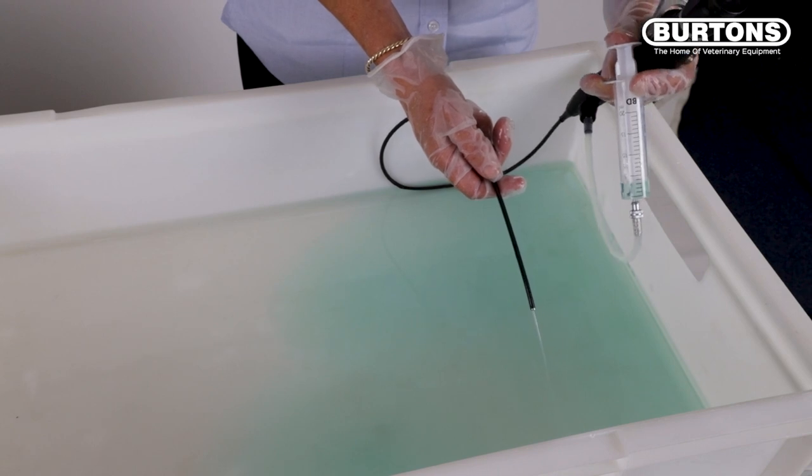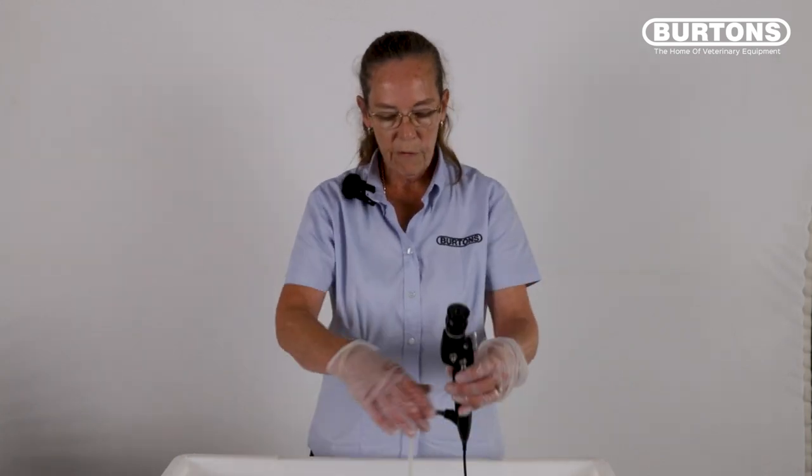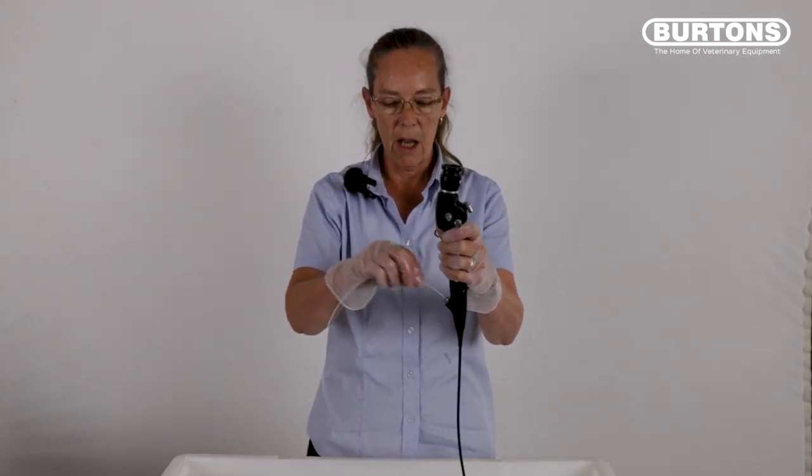Leave the endoscope to soak for half of its allotted time. At the end of half of its allotted time, remove the flushing adapter and pass the cleaning brush directly down through the channel of the scope. The double-ended cleaning brushes are a pull-through system and facilitate two brushes in one. Repeat this process as many times as needed until you're confident all clinical pathology has been removed from the channel.